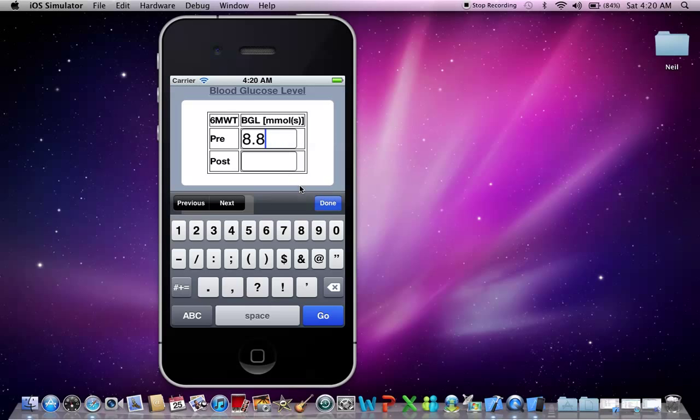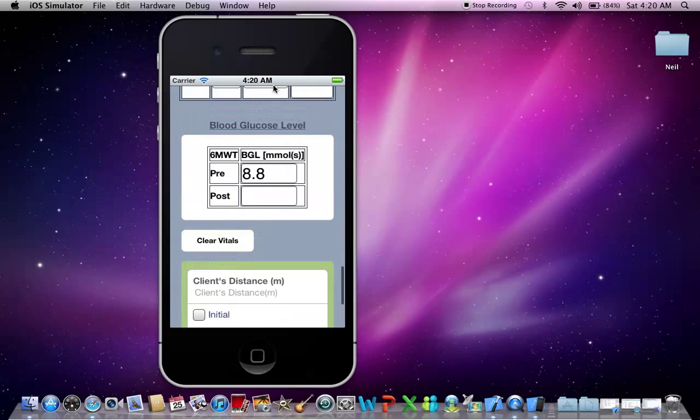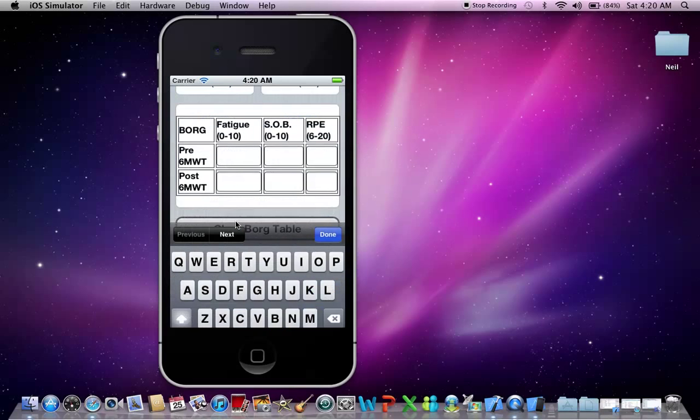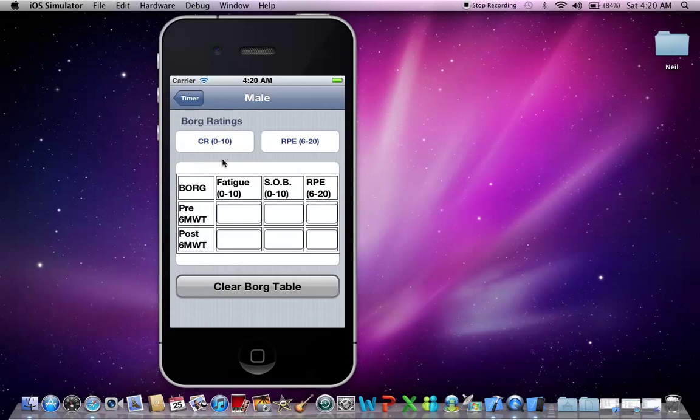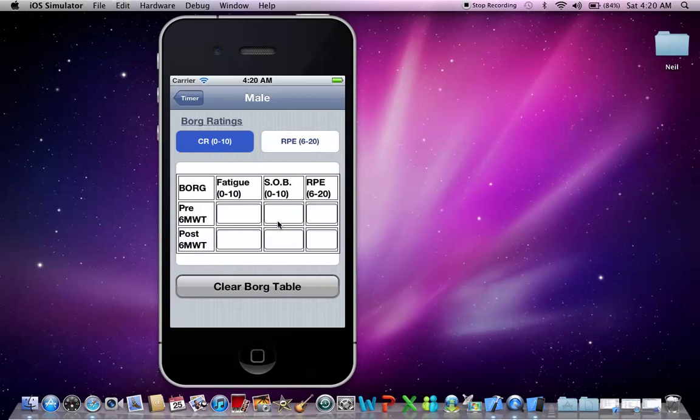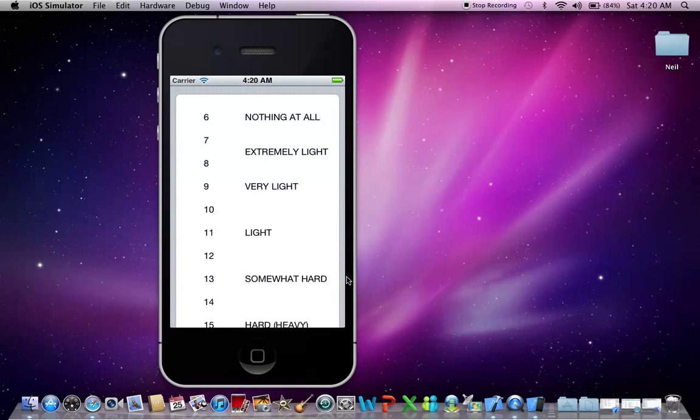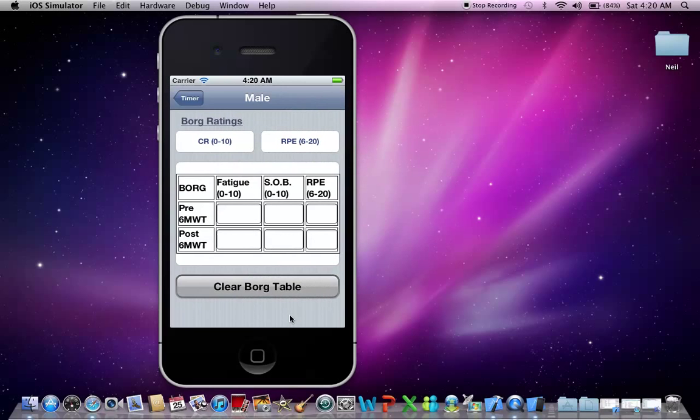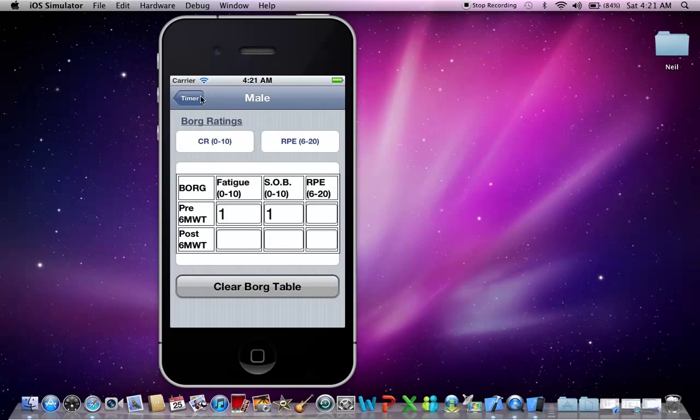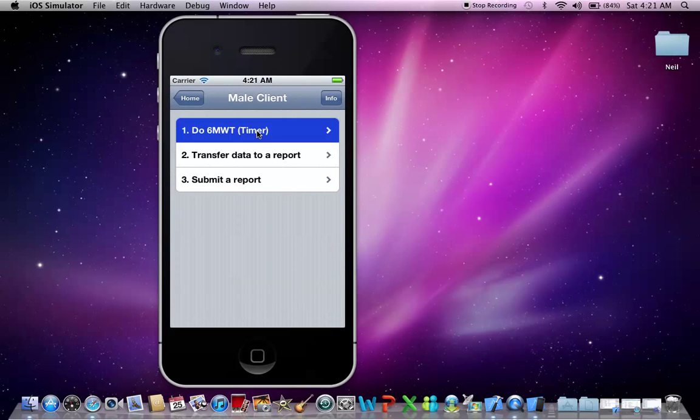Okay, now what I can also do is roll back up and do some Borg scale ratings before as well. So I've got my zero to 10 scale here and also my six to 20 scale here. Let's go back. So for example, I'm going to put in one, one for fatigue and shortness of breath.